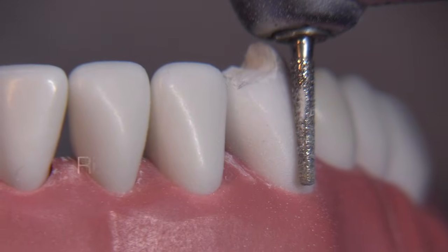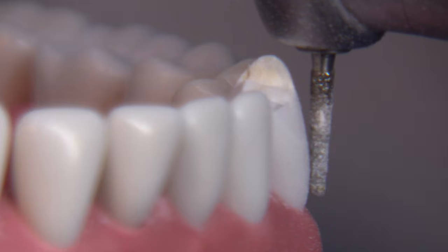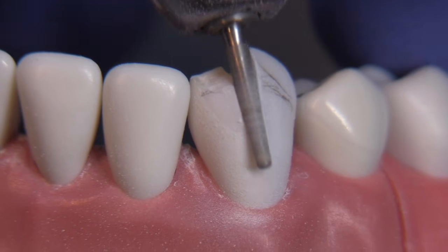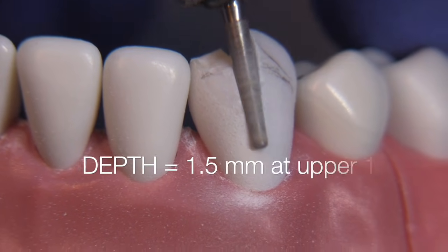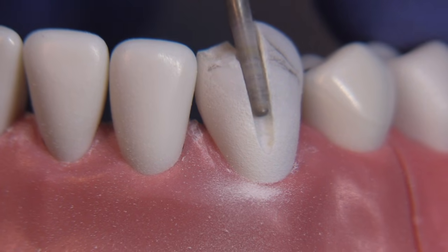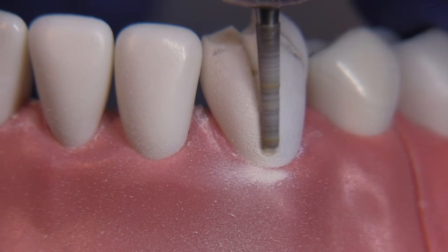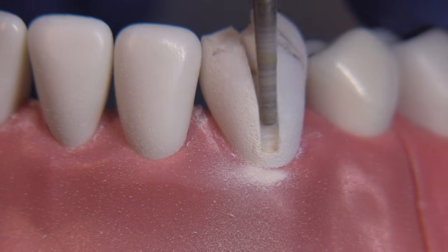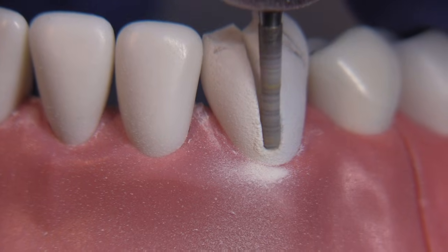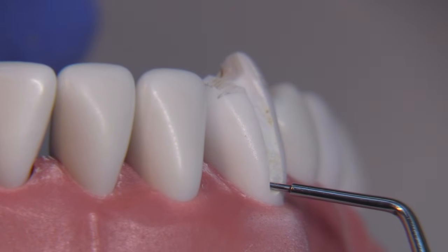When you reduce the facial, follow the contours of the tooth — we're going to get our retention from the gingival third of this preparation faciolingually. We cannot make the incisal two-thirds straight up and down; we've got to follow the contour so that the final result is aesthetic. We need to reduce about 1.5 millimeters at the upper portion and 1 to 1.2 millimeters down at the shoulder. The bur is nicely shaped for this purpose — those are exactly the dimensions we want; we just have to tip the bur.